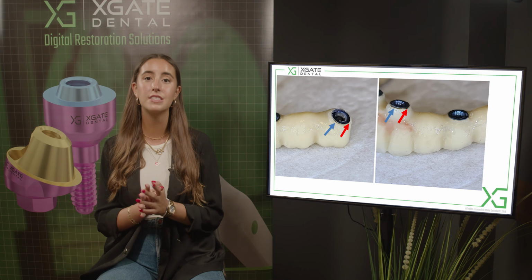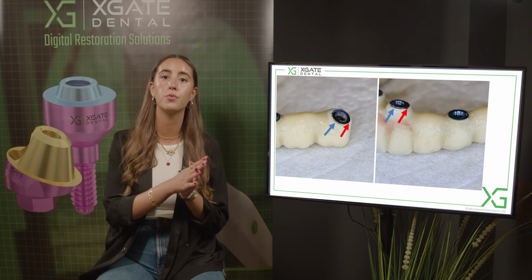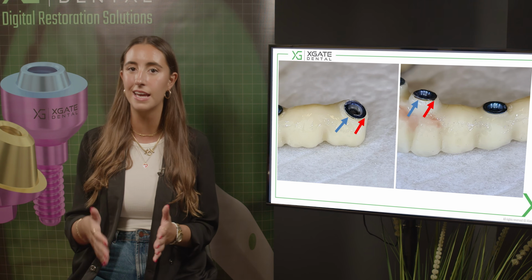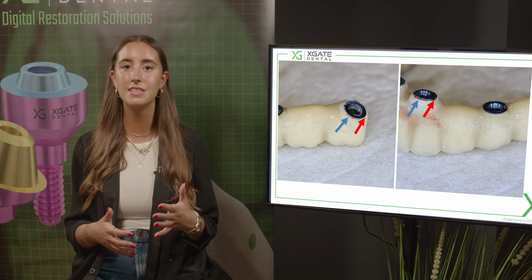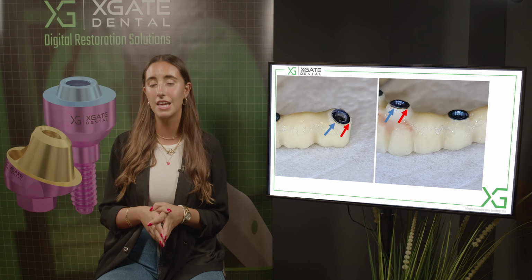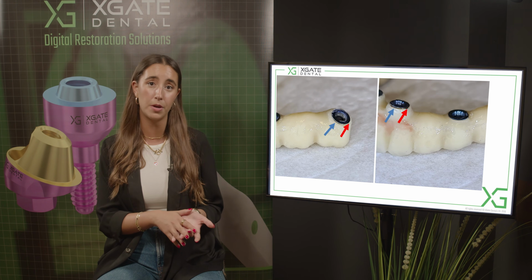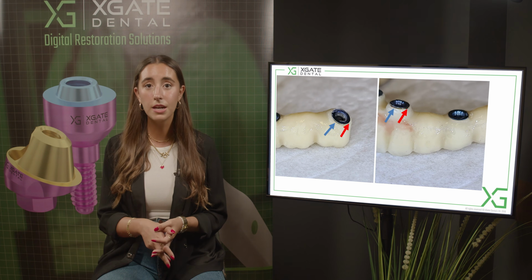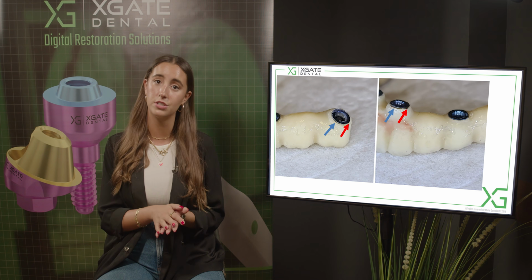In the modeling program, you need to position the scan abutment model on top of the real scan abutments. And when you scan the posterior teeth, it's sometimes hard to scan them, and you have gaps or places that didn't scan very well. So it's hard for the technician to position the scan abutment model on top of the scan abutments. And you can have some deviation there also. The higher the scan abutments or the multi-unit, the bigger the deviation you'll have.